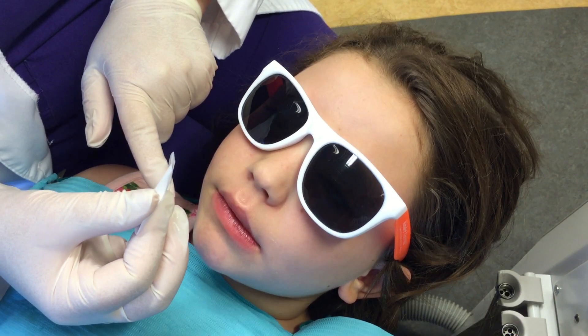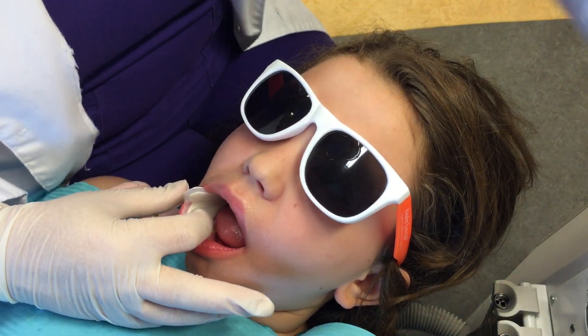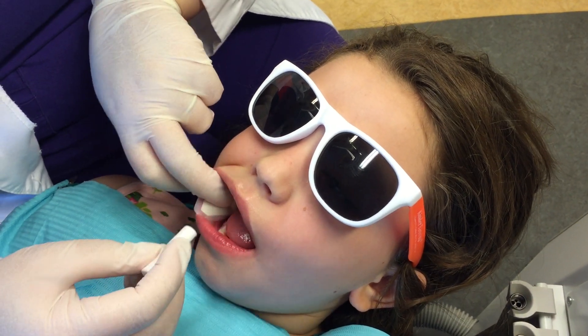Now we're going to isolate the tooth. Can you open big? I like to use dry aids and cotton rolls.